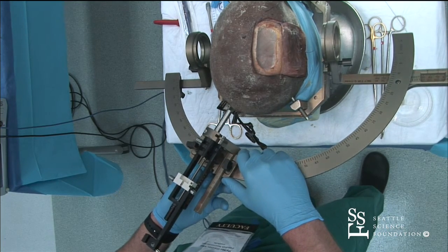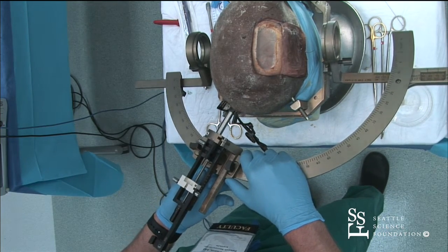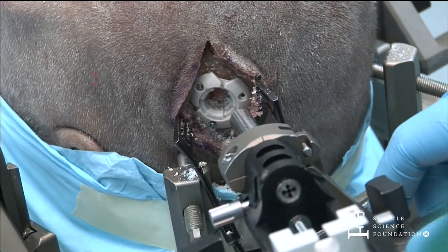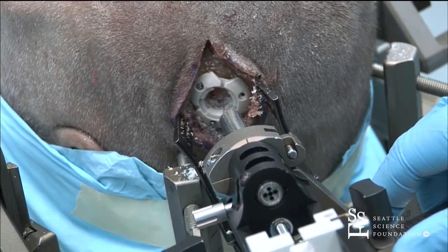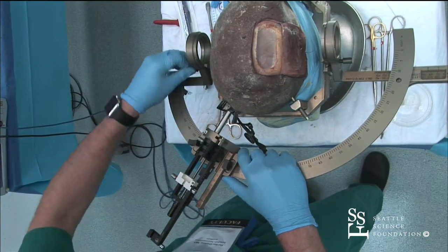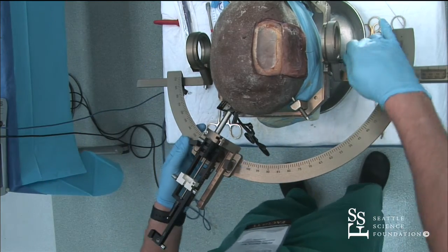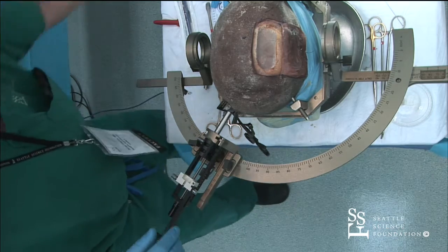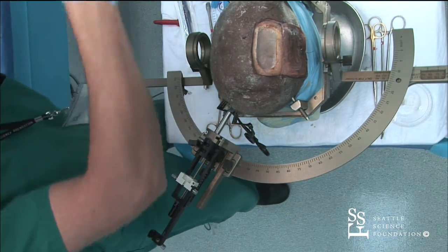And let's see, we're doing 100.6 and 166. So I'm just going to put that on. And we won't demonstrate, we're not going to be able to get a post-op CT for this.